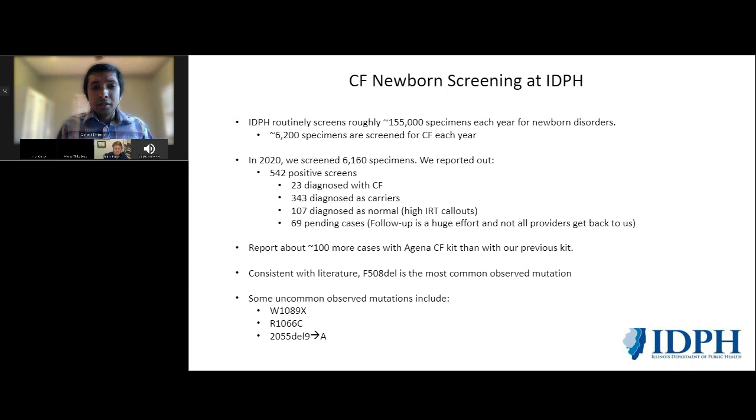And so I guess the one caveat with the Agena is that it's a great assay as far as being able to automate it. It does well being able to set up for automation. There is a high barrier for data interpretation because it's not an automated process. There are manual interpretations that need to be made. So there is that training for your bench technicians when they're reviewing the data.